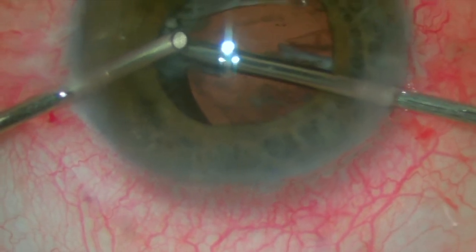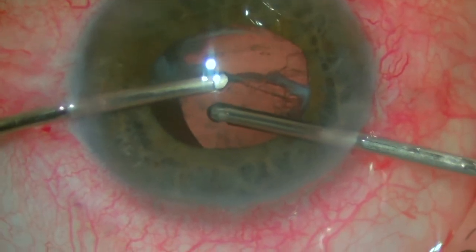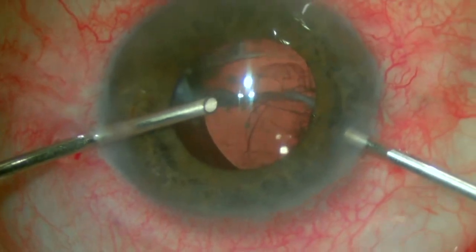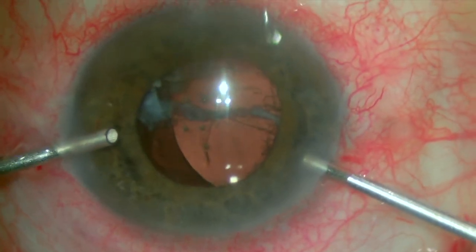In this way, we increase the amount of time the vitrector port is opened, and thus it gives time for the vacuum to work and really engage the fragments. But it doesn't really work here.